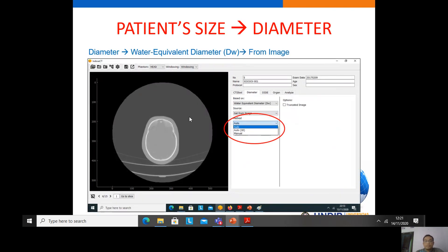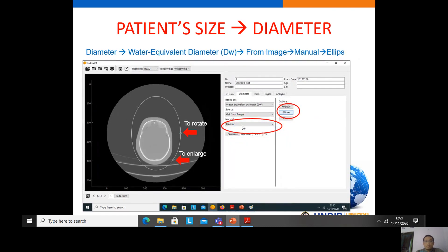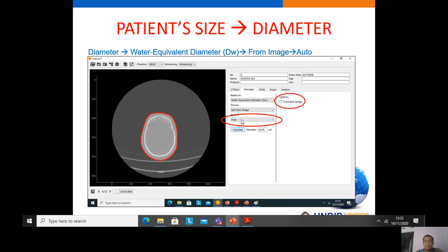To calculate water equivalent diameter from the image, there are also three options: auto, auto 3D, and manual. For manual calculation, we have two options: using polygon or ellipse. If using ellipse, we click the ellipse button, rotate and enlarge the ellipse to fit the patient border, then calculate to get the water equivalent diameter. If we use auto, the software automatically calculates the water equivalent diameter.